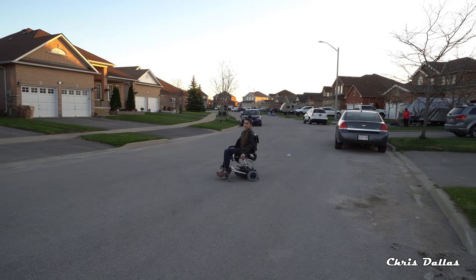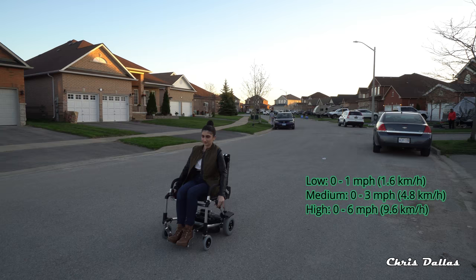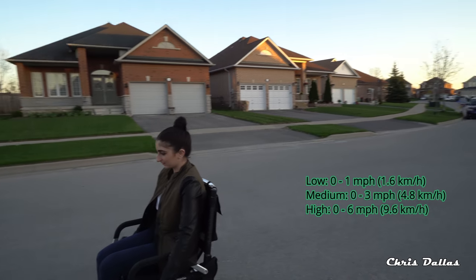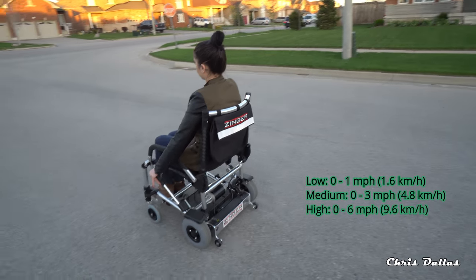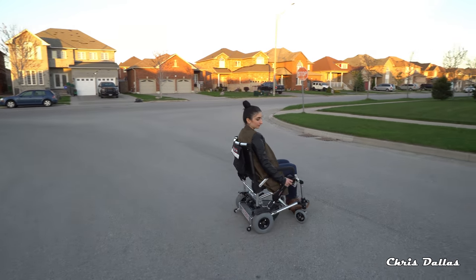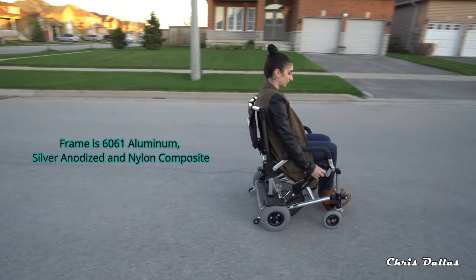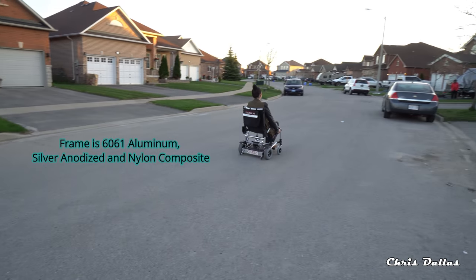So you have three different speeds: low speed, medium, and high. The high speed goes up to 9.6 kilometers an hour, but you can still control the speed by the actual trigger. If you press the trigger hard, it'll go faster. If you press it just a little bit, it'll go slower, even on the fast speed.